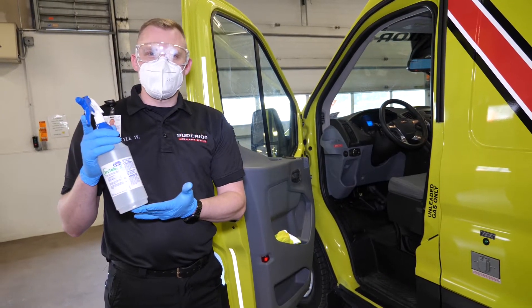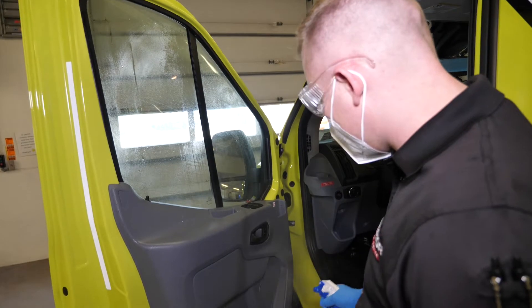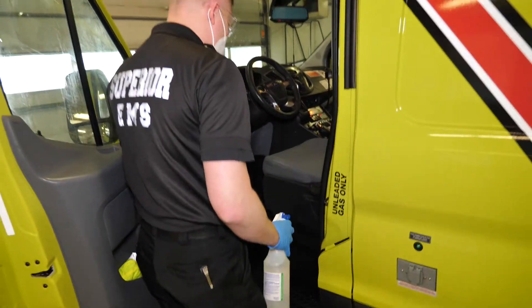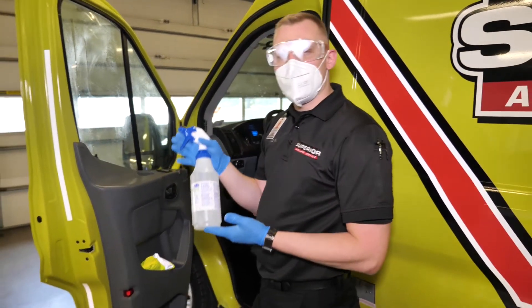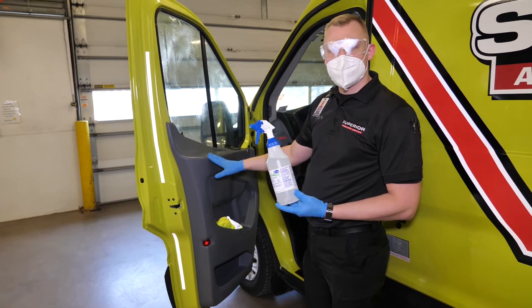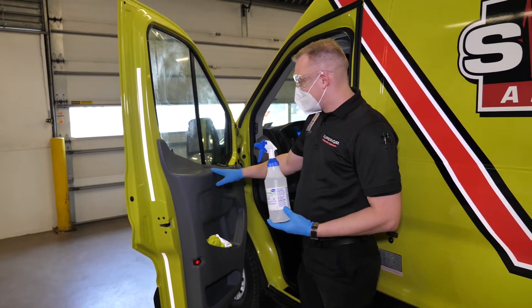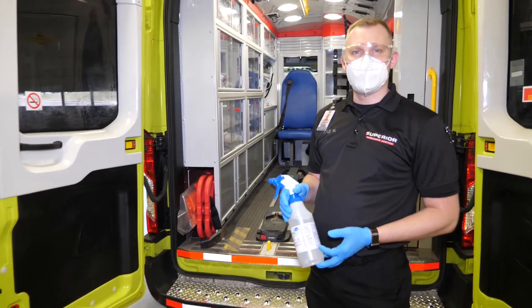Once our spray bottle solution is dissolved, we want to take the spray and just put a fine mist over the top of the vehicle, making sure we hit all surfaces to properly decontaminate it. You don't need to go overboard — just a fine mist on top of the surface will make sure that it kills. Contact time is one minute to kill with this new process. It's important to note that for demonstration purposes, I did not spray the entire vehicle.